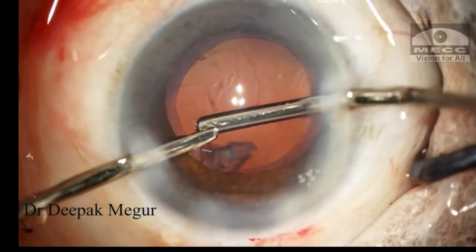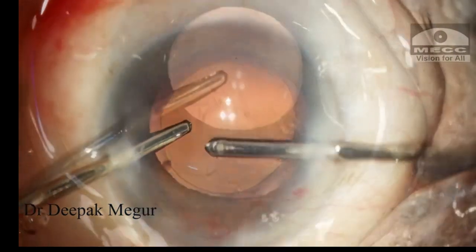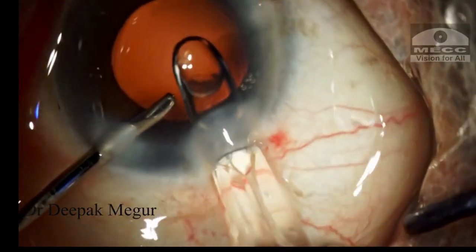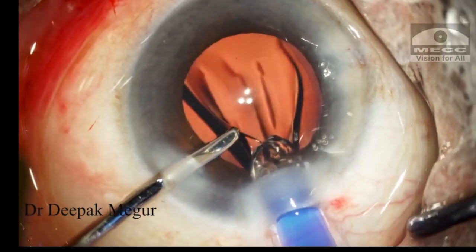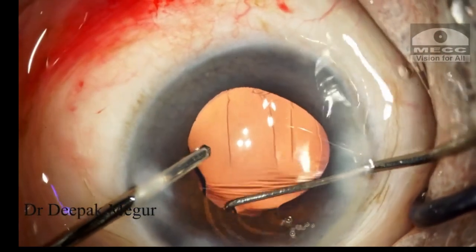The cortex is then aspirated out. Finally, it's time for the lens to be implanted. I'm using the hydroimplantation technique to place the lens into the bag in this case.